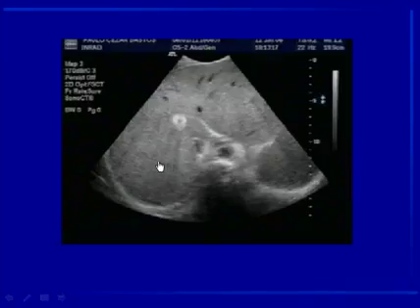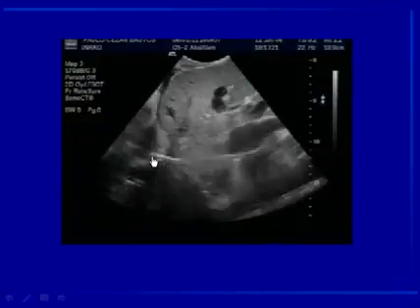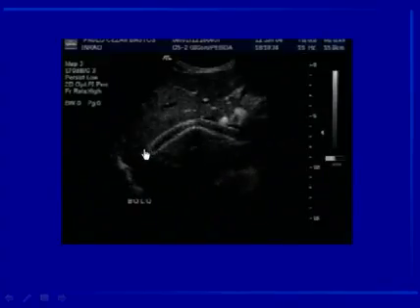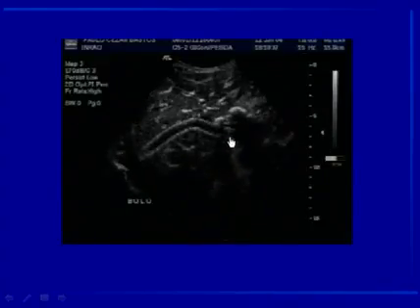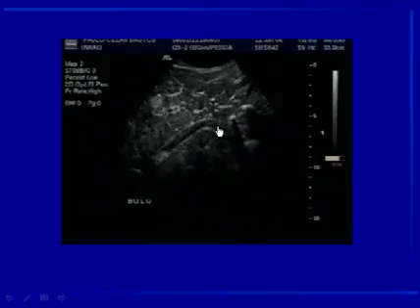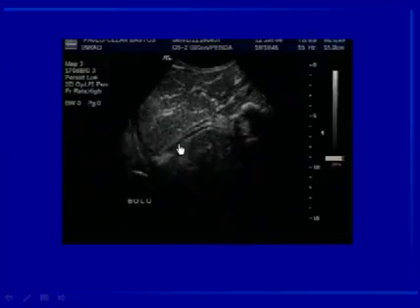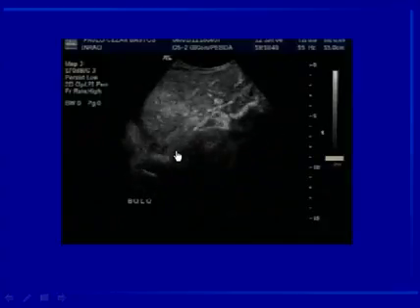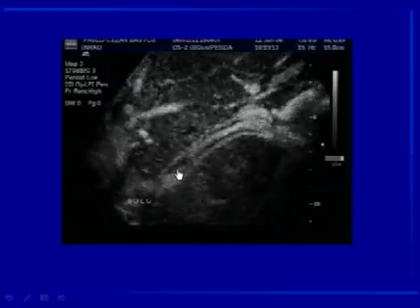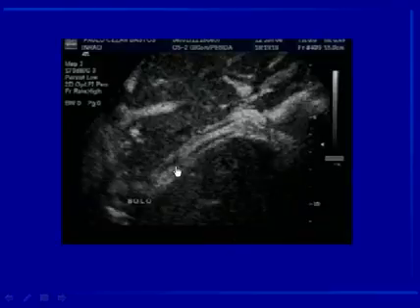In this case, using contrast enhanced ultrasound, we identified the TIPS here and 2 points of stenosis, in the middle and in the distal third of the stent, as you can see here.